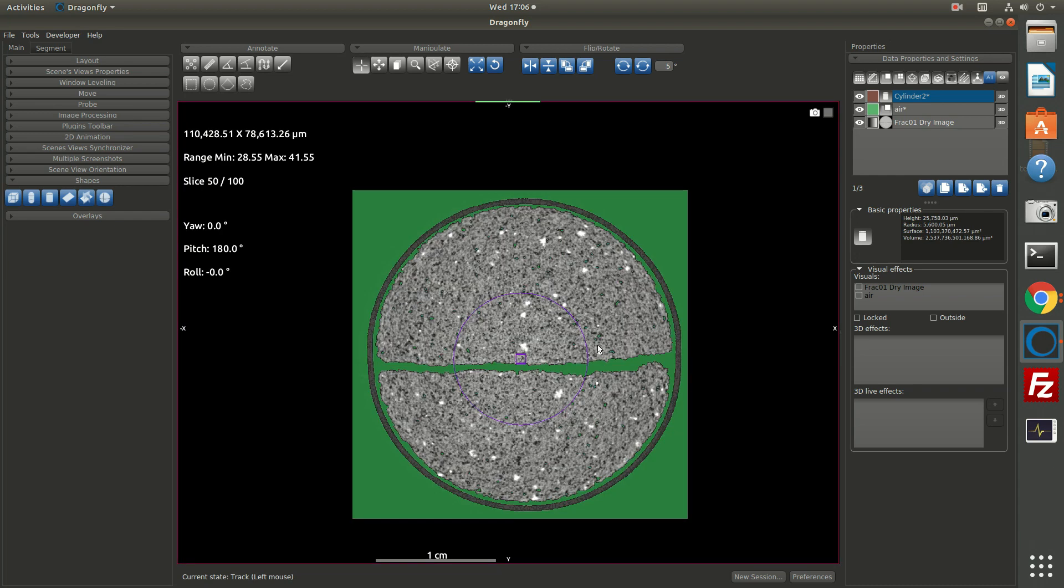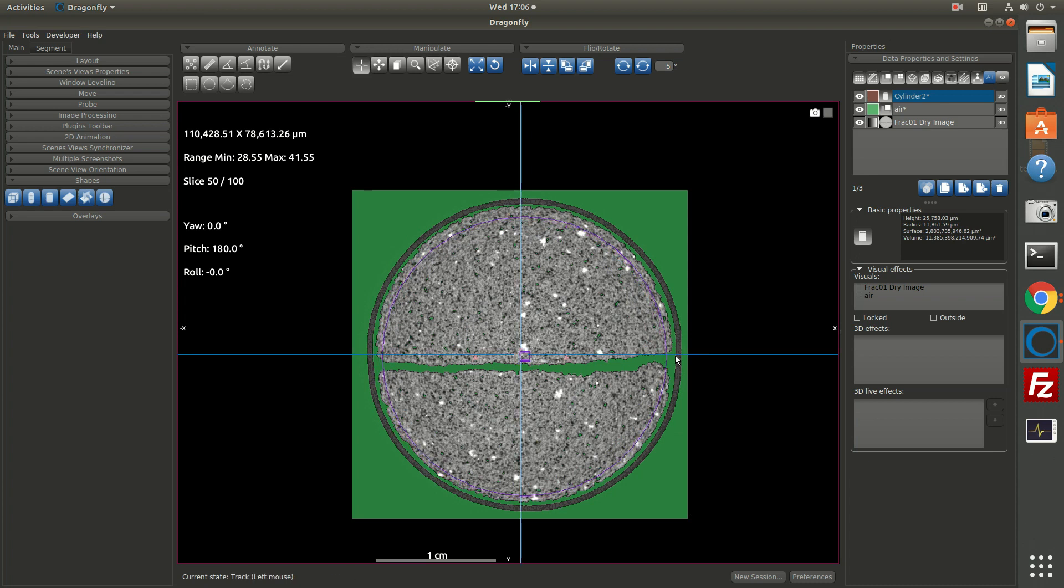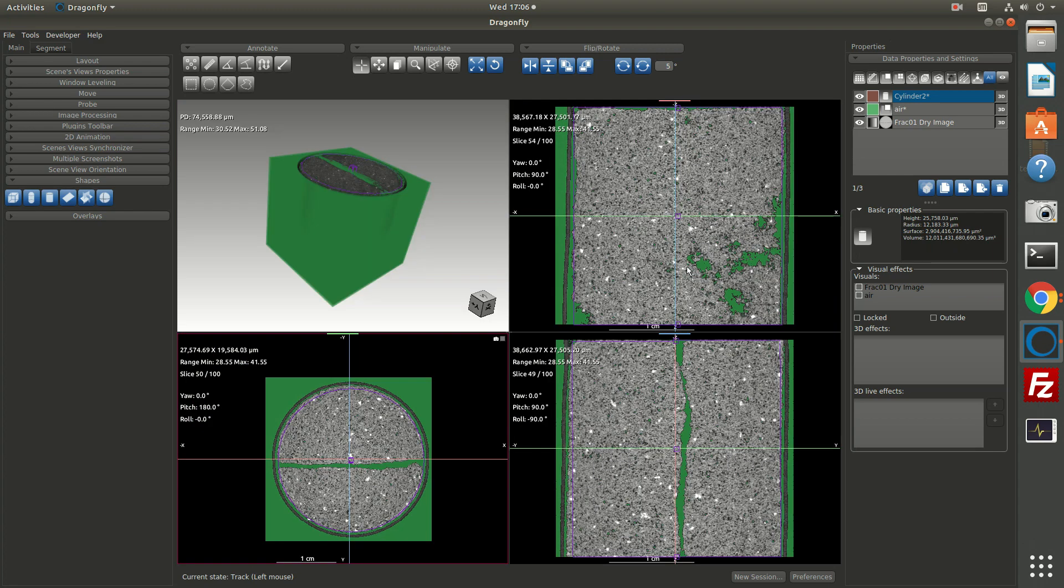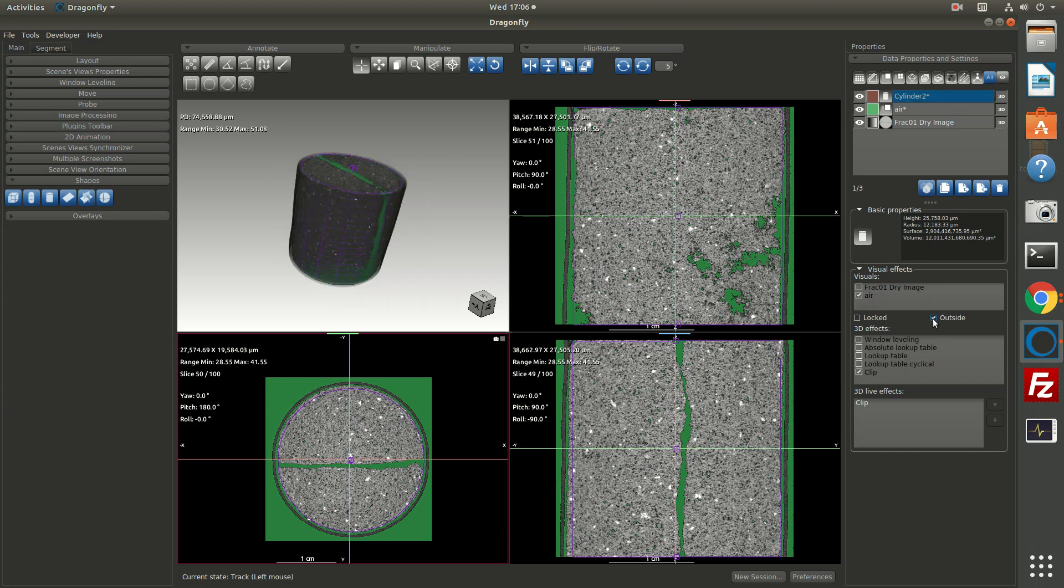If I double click here, I can change the diameter by just dragging on the edge. You can also grab in the middle and drag to reposition that vertex of the cylinder. So we can do something like this to apply a mask. Now at this point, we've just created a cylinder. We can use it for visual clipping if we like. So for example, if I come over on the cylinder and I say I would like to clip the air ROI.